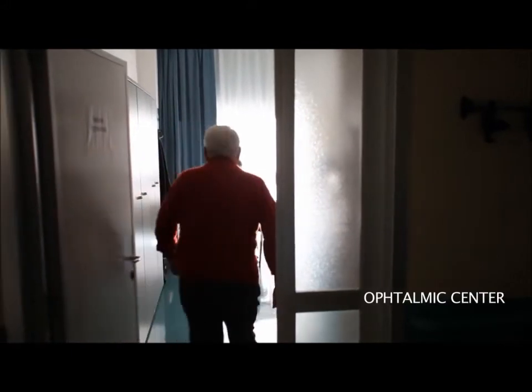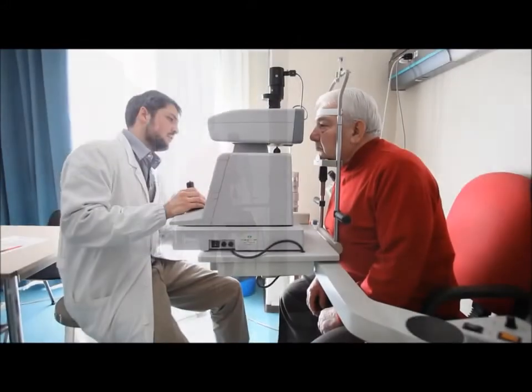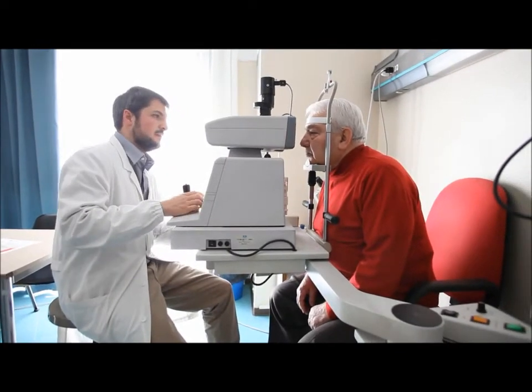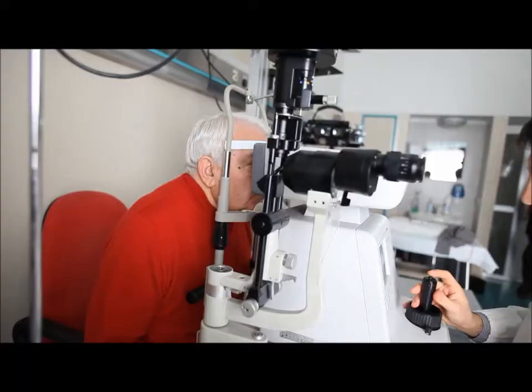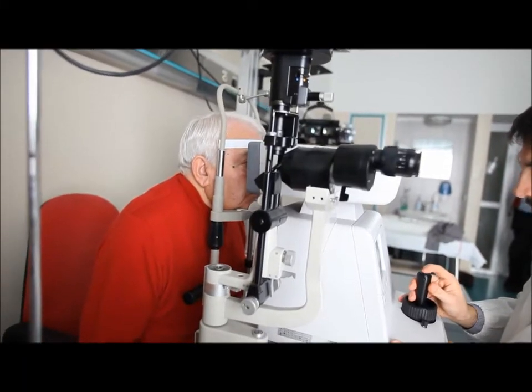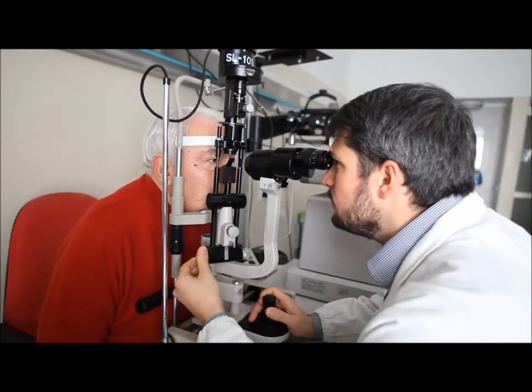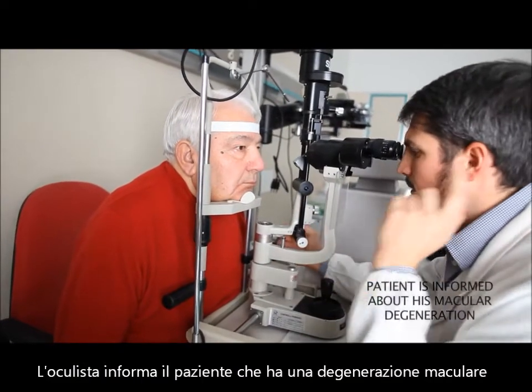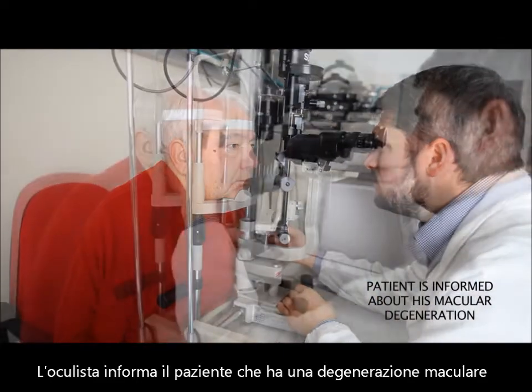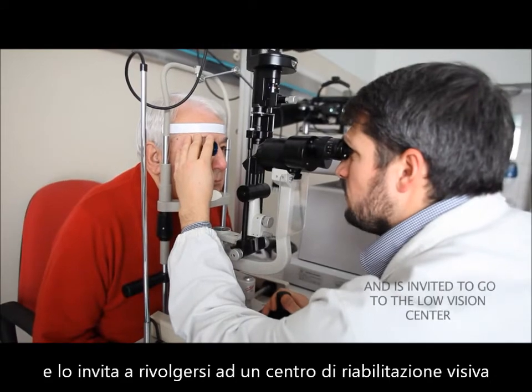an appropriate solution. The clinical analysis of the physician determines the cause of the problem, and when atrophic macular degeneration is diagnosed, the doctor may refer the patient to a center for visual rehabilitation. The first question a patient is asked is what his expectations or priorities are, in order to understand if indeed an effective rehabilitation program can be developed.